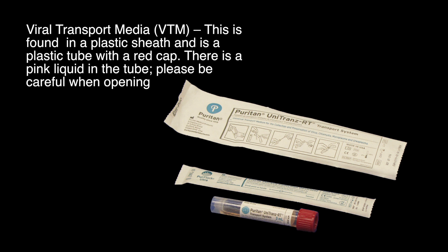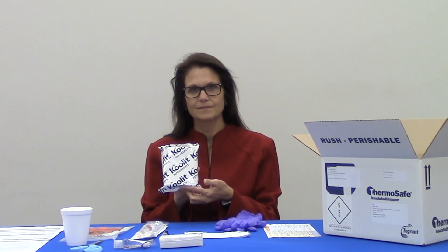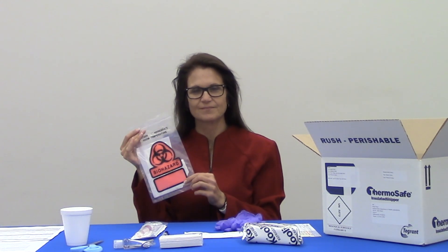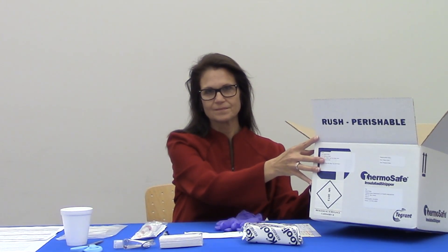Please be careful when opening the viral transport medium. Use only the swab provided in the plastic sheath with the plastic tube — this is very important. You will also find a cold pack — keep this in a freezer upon receipt and do not remove it until you're ready to ship — and a plastic biohazard bag containing absorbent material, which will hold the tube in place during shipment to the ISDH. Remember to leave the absorbent material inside and close it securely. Finally, there is a styrofoam shipping box for shipping the specimen to the laboratory for testing.